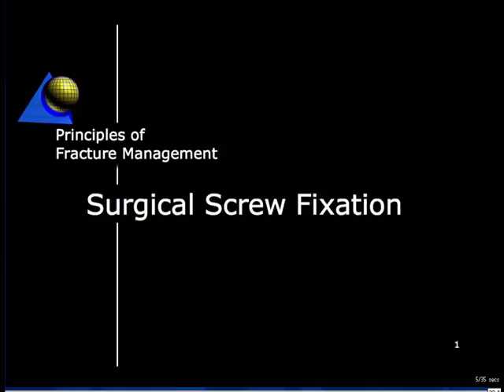The aim is firstly to describe the screw as a mechanical device, secondly to identify its physical attributes and its functions in surgery, and thirdly to outline the techniques for insertion in bone. After studying this guide, you should be able to identify the basic screw forms and sizes of the AO armamentarium and outline the principles underpinning the surgical techniques of using screws to achieve a variety of outcomes.